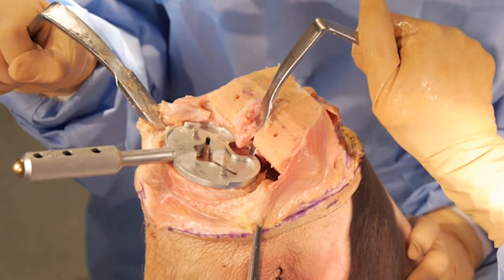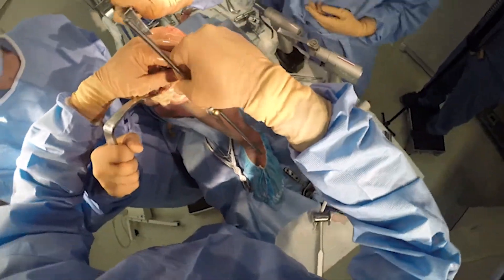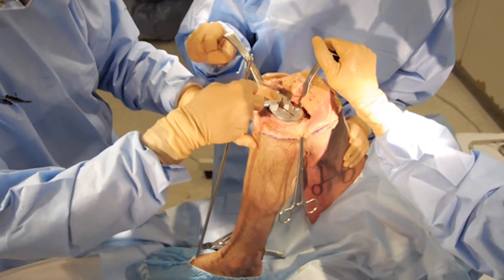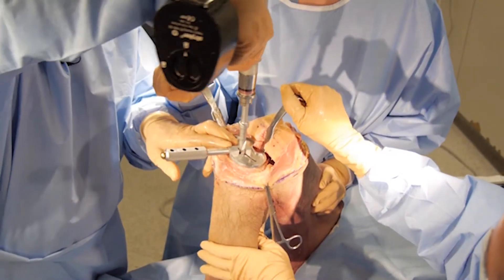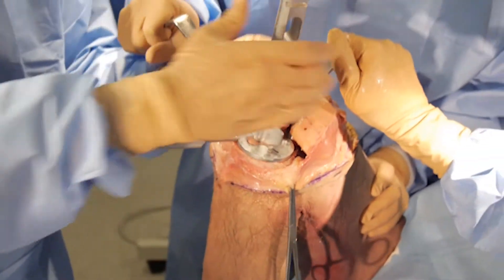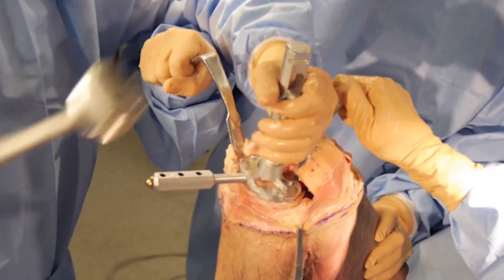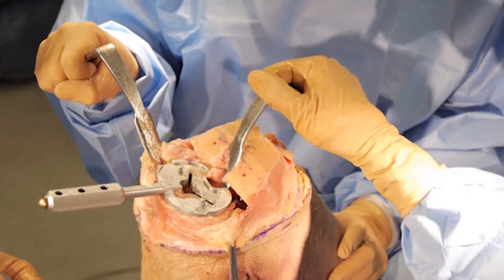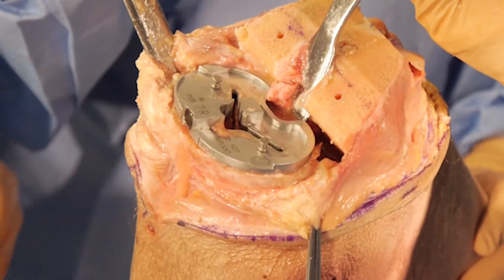Now I'm ready to complete my tibia. This is the last time to check your cut before you prepare it. I'll give it one more check — I like where my alignment rod is going right down the shaft of the tibia. Now I'm going to drill the proximal tibia and complete it with the punch, then use a slap hammer to remove the guide. My tibia is done and I'm ready to make the notch cut for the distal femur.